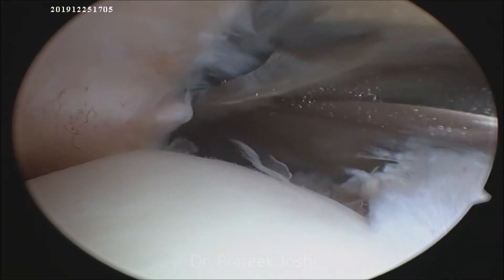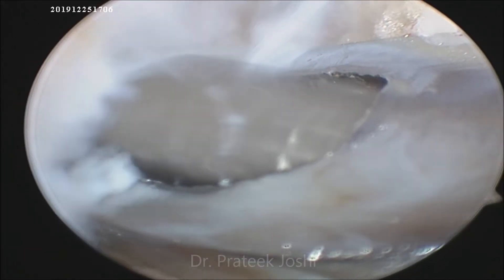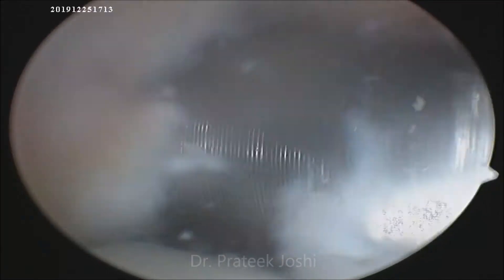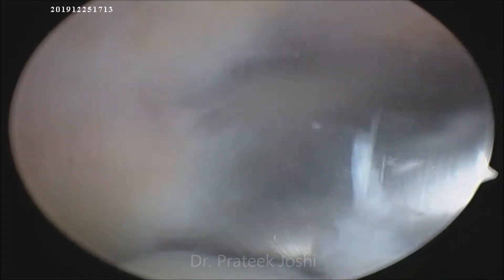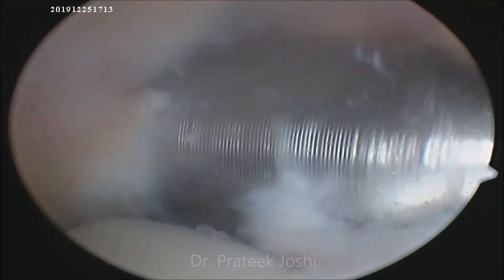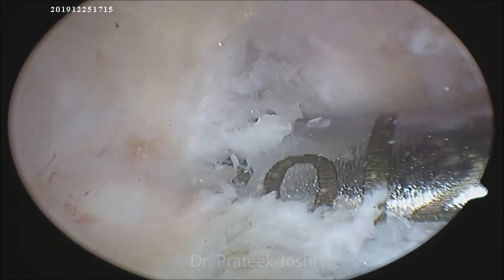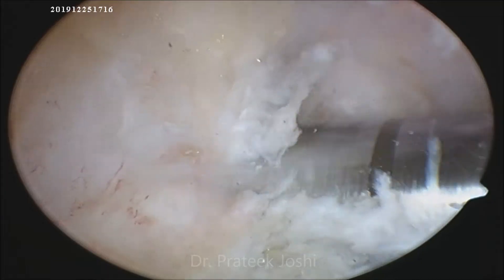After having identified the femoral ACL footprint, we use a 5 millimeter offset femoral aimer to drill the femoral tunnel over a guide wire. After the guide wire has been inserted, we drill with a 4.5 millimeter drill bit over the guide wire. The length of our femoral tunnel is 35 millimeters. Now we will be drilling with an 8 millimeter drill bit, which corresponds to the diameter of our graft, to a depth of 20 millimeters.